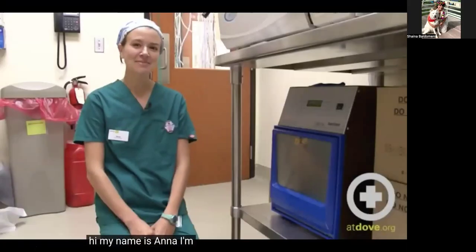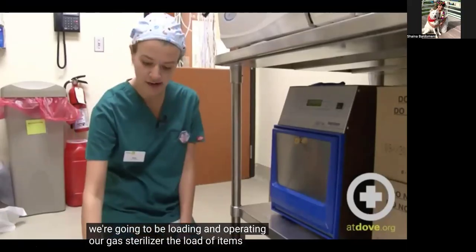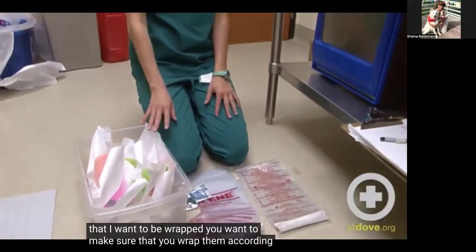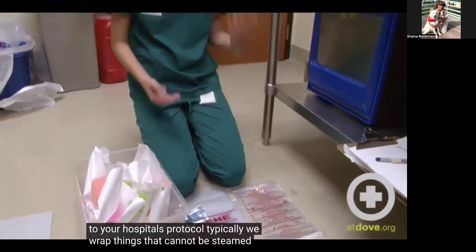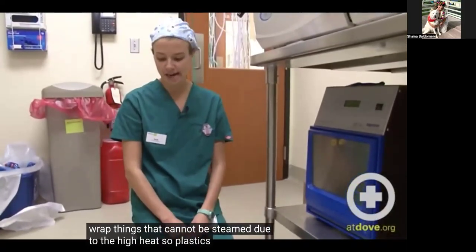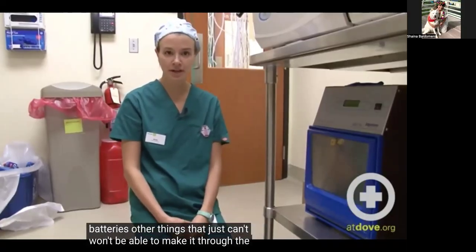Hi, my name is Anna. I'm a surgery assistant here at Dove Lewis, and today we're going to be loading and operating our gas sterilizer. The load of items that I want to be wrapped, you want to make sure that you wrap them according to your hospital's protocol. Typically, we wrap things that cannot be steamed due to the high heat, so plastics, things with batteries, other things that just won't be able to make it through the autoclave.